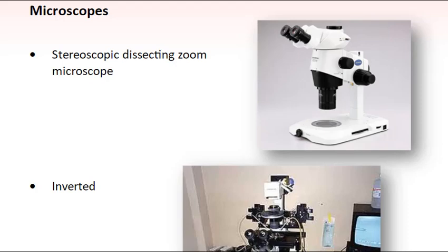Stereoscopes should be chosen that have a generous working distance between the stage and the objective to accommodate multiple kinds of dishes. Workstations built into hoods that have heated surfaces and IVF chambers can accommodate a variety of different types of stereoscopes. Inverted microscopes provide much greater magnification compared with stereoscopes. Inverted microscopes outfitted with microinjection equipment allow the performance of ICSI and embryo biopsy and are standard in virtually all IVF laboratories. The use of various contrast techniques improves the visualization with inverted scopes, allowing increased distinction and visualization of the interior of the oocyte, sperm head abnormalities, etc.